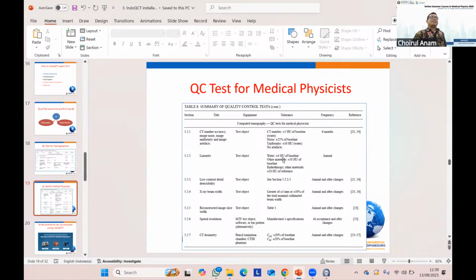But for quality control, we assume that one slice is similar to another, so it is enough to measure the image quality from a specific slice. Theoretically, of course, all images are not the same. But measuring the image quality in all images is very tedious and time consuming. Thank you very much.